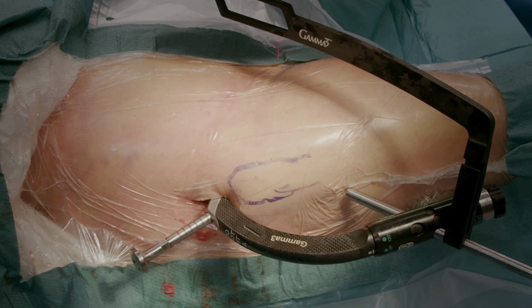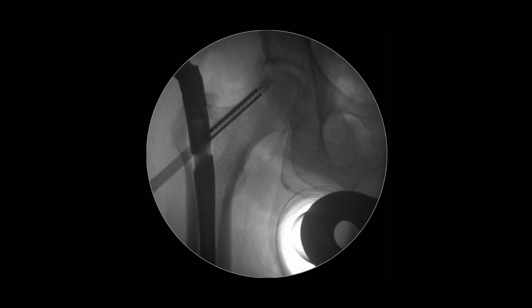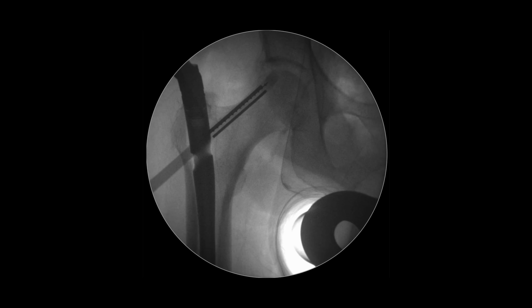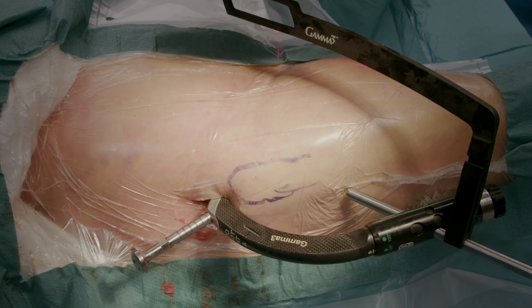Let's take an image. The image shows that the nail is slightly proximal, and we need to impact it further distally.